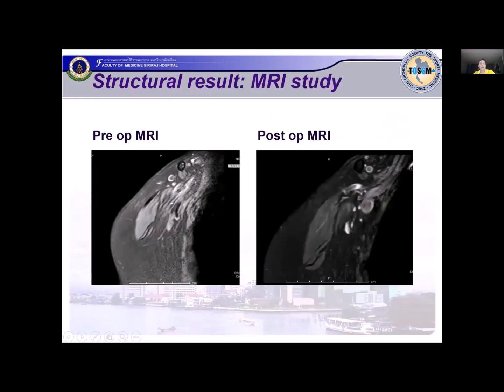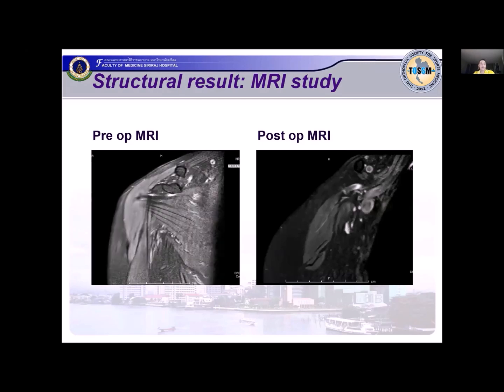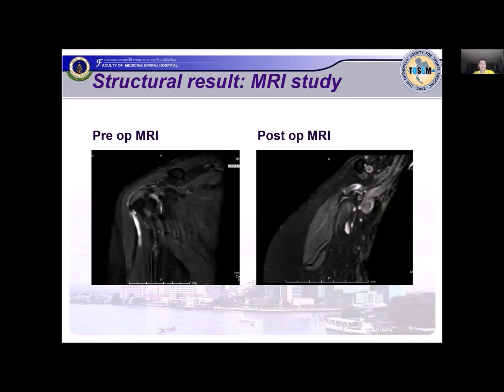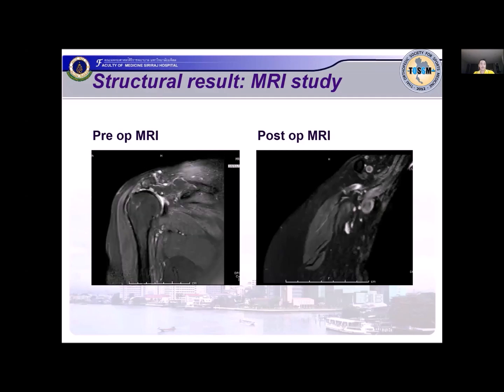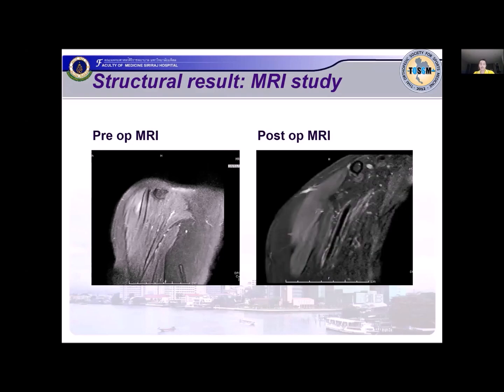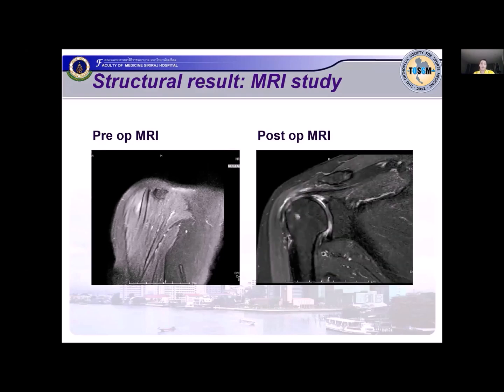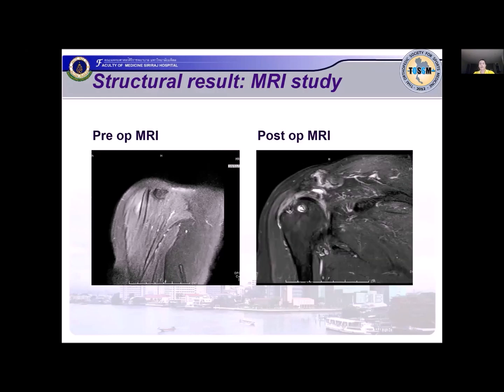This is another one, the pre-op MRI, and the post-op MRI. Quite good continuity of the tendon and also the graft.